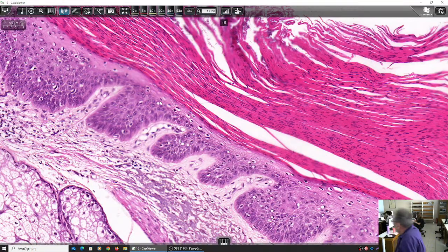What did you learn? Pre-invasive neoplasia. They are not cancerous cells. Why? Because they are devoid of the hallmark of malignancy, which is invasion. So how do they call them, these cells?